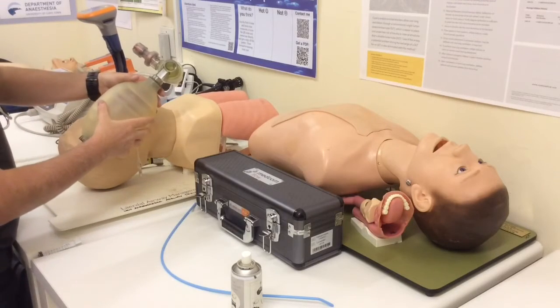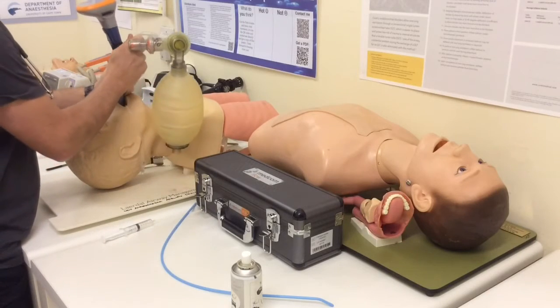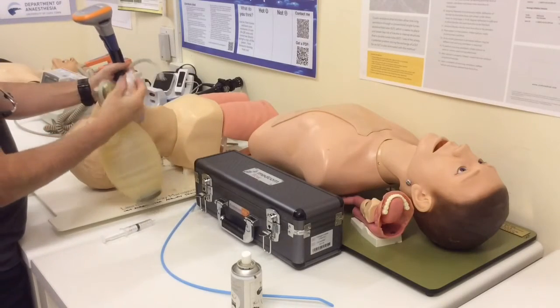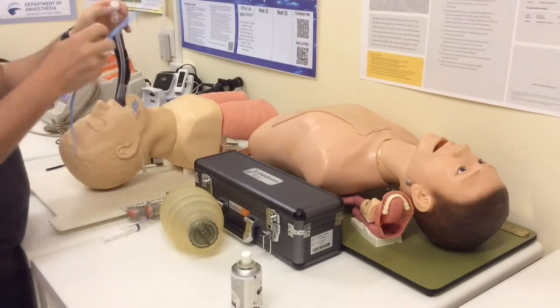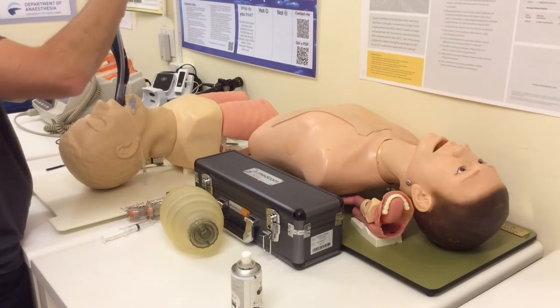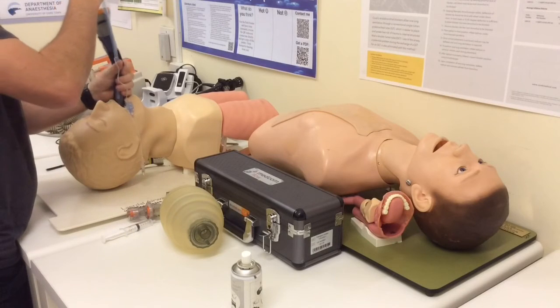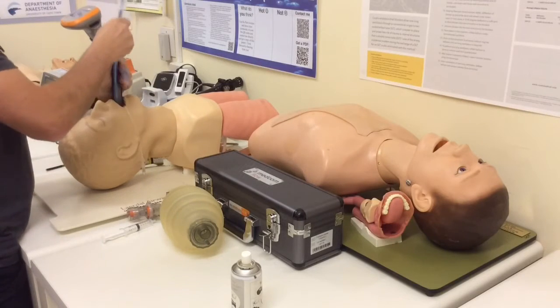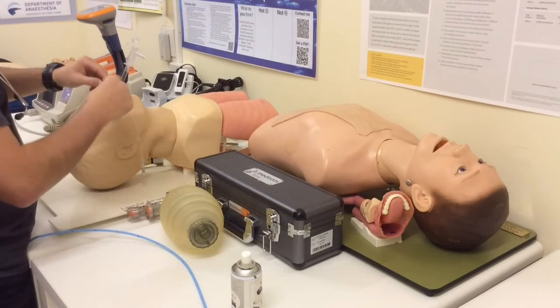If I were to struggle, let's just rewind this a moment. And let's say that I was really struggling to get a good view on my monitor screen. What I can now do is I can bring this angle connector into play. So let's just presume I've had this connected and ventilating away. I can pop open the elbow connector, and I can now pass my bougie down through here. And on the other end, when it pops out, I now have a completely steerable little tip with a coudé tip that I can get in around a tricky corner, and once again then deflate cuff, advance tube, and remove the bougie, re-inflate the cuff, and keep ventilating all the way through.